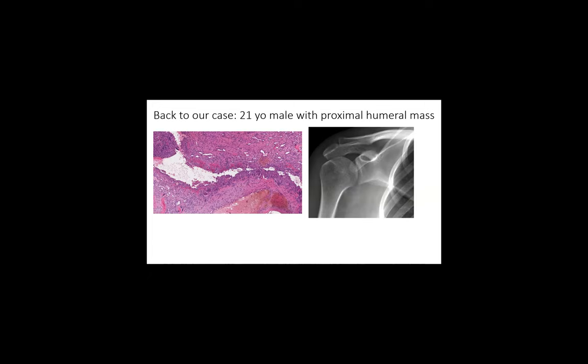Synovial chondromatosis, going down the list, can be in the joint and can appear as subtly mineralized areas. Okay, so the morphology in this case was pretty good for aneurysmal bone cyst. And since there was really no concern for an underlying primary lesion, indicating that this could be a secondary cystic change, we also did a G34W immunohistochemistry (IHC) marker, and it was negative. So in that case, we felt that this lesion fit for primary aneurysmal bone cyst.